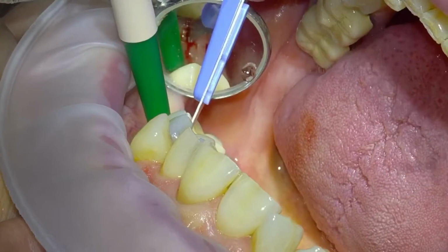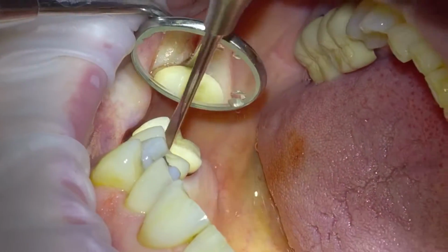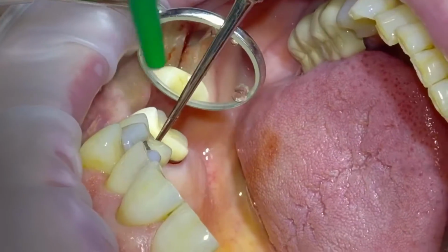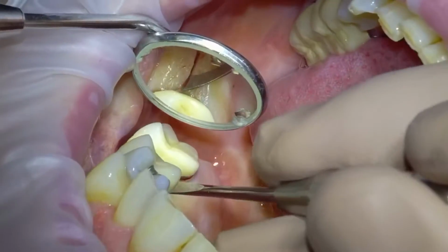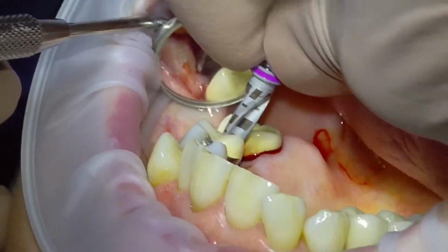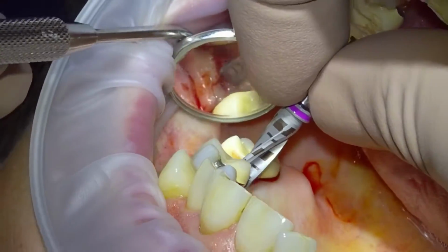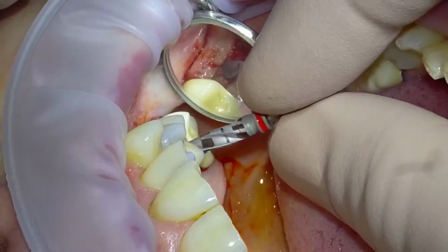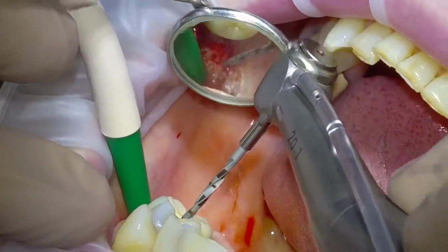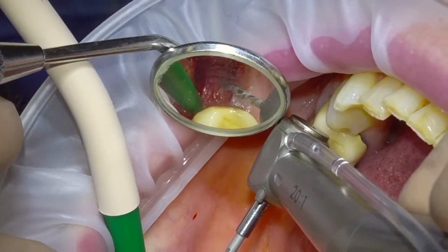So here we're doing a little crestal incision, and then we just very simply elevate the soft tissues. We utilise anaesthesia, so patients, as you can see, are very numb. Here I can use just a little one of the drills from the sequence of the BLX protocol to work out dimensions for which size of implant to place. And we're going to put a 3.75mm BLX in here, so that gives us plenty of mesiodistal bone.